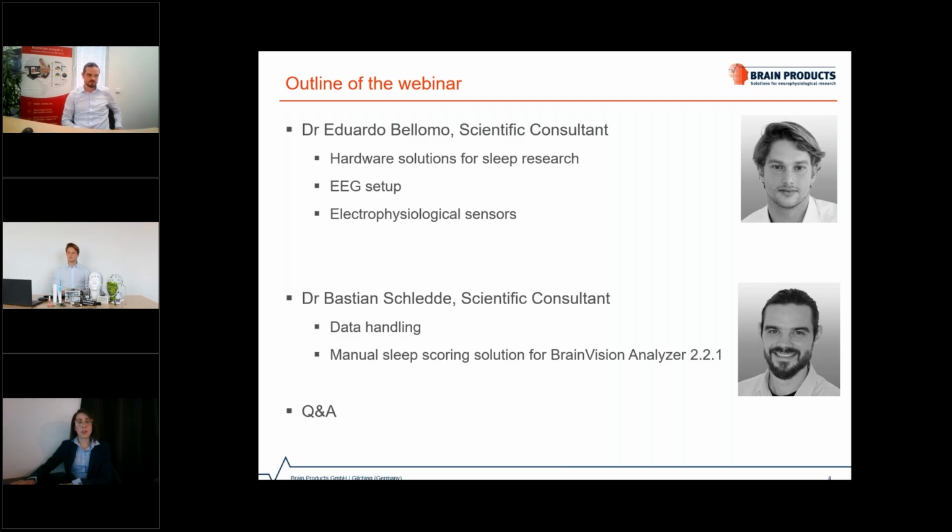Our first presenter is Dr. Eduardo Bellomo, and he is a scientific consultant in our sales team. Eduardo's scientific background is multidisciplinary, drawing on experience in sports and physiology with a focus on EEG and additional peripheral electrophysiological sensors. Today, he will talk about EEG hardware and other relevant accessories that Brain Products provides for sleep researchers.